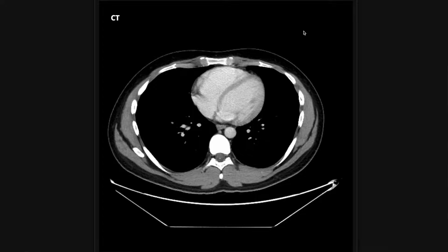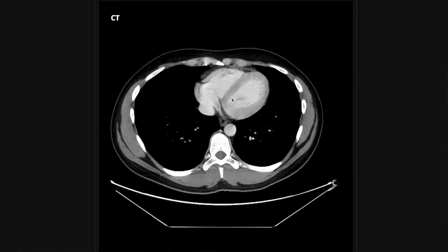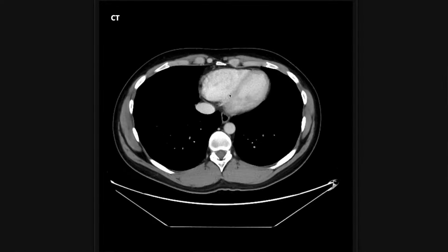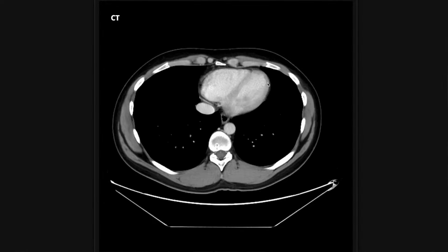Now on to my search pattern. The first thing I look at is the thorax — you get a little bit of the lower thorax and that includes the heart and lungs. I take a look at the heart, checking for pericardial fluid, coronary artery calcifications, and LV thrombus. Sometimes you can catch those in the left ventricle.